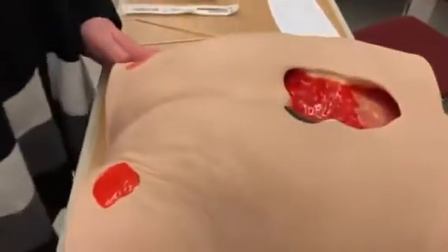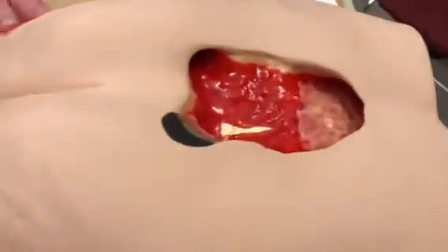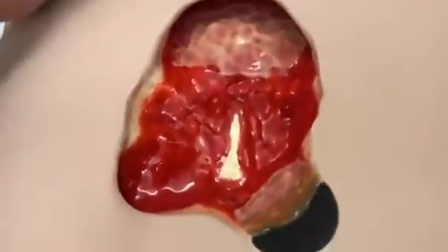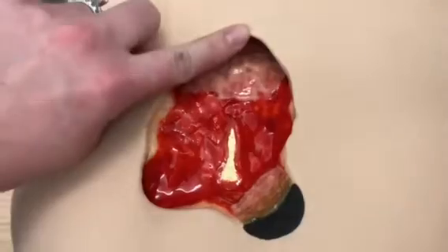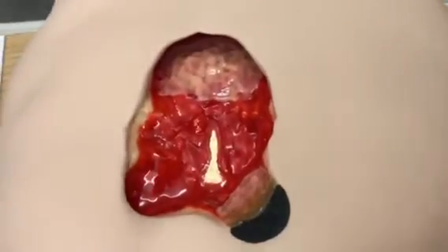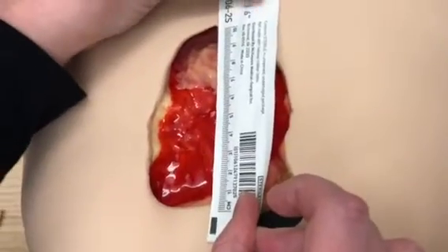First we're going to show you how to measure the wound. It's always length by width. So if this is the head up here, we're going to measure the length first and it's always in centimeters. So here we have about 10 centimeters.